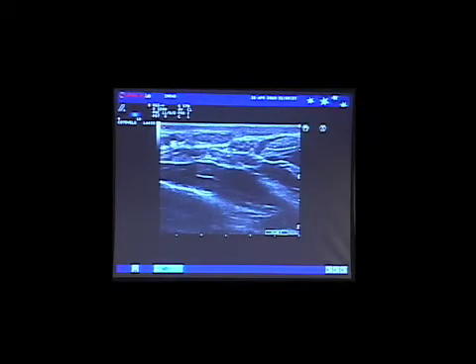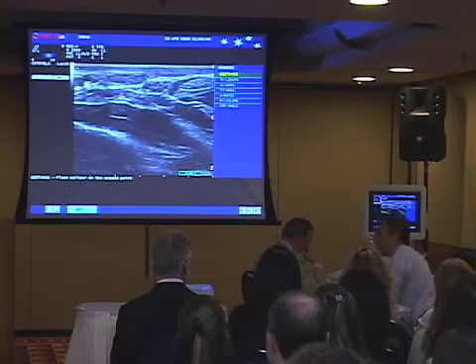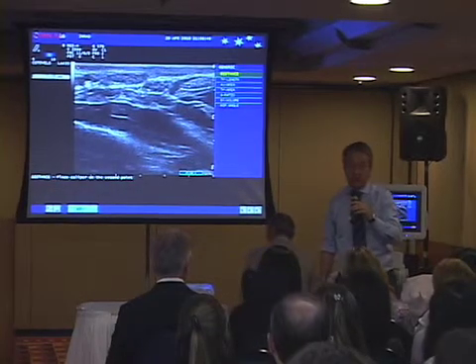And in cases of an injury, you will see a scarring tissue enveloping the nerve, or you can see a neuroma of this very small structure of 0.3 millimeter inside, but very important from the clinical point of view. So this was the last structure to see. Thank you very much for your attention.